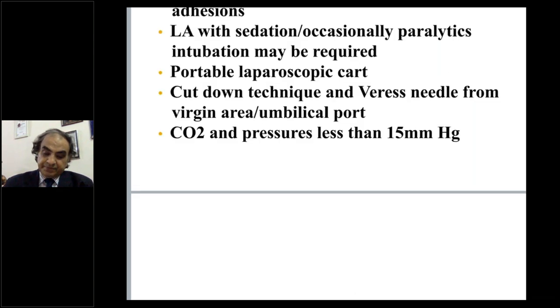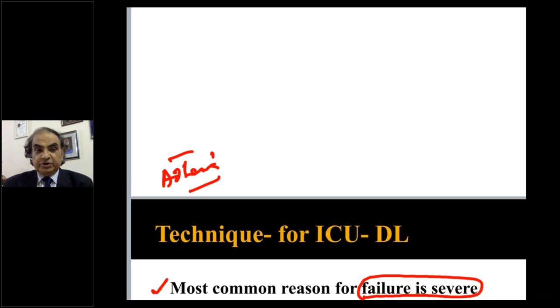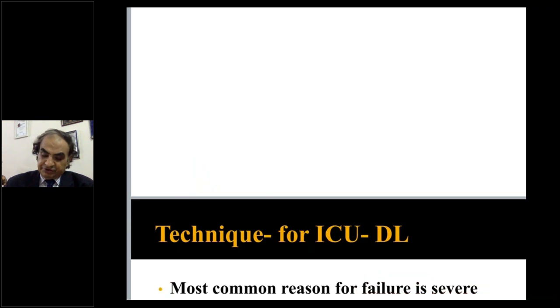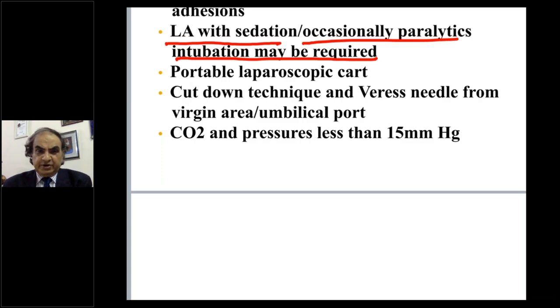Now the technique. Mostly you will be dealing with lots of adhesions, and the most common reason for failure is severe adhesions. Otherwise you can do it bedside. Since you are using very low pressure, you may not be able to get a good pneumoperitoneum. So the most common reason for failure, if you're asked, is adhesions, and we should be conscious of it. Local anesthesia with sedation, occasionally paralytics, intubation may be required. If they're intubated, then you don't need any of these.